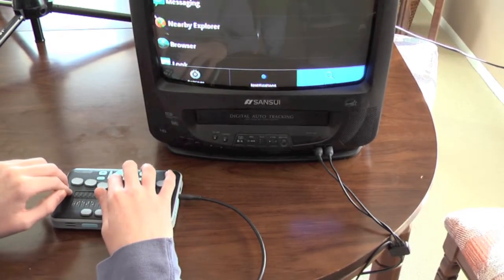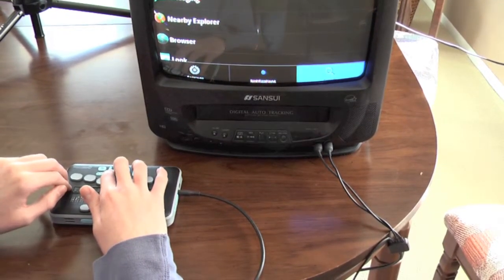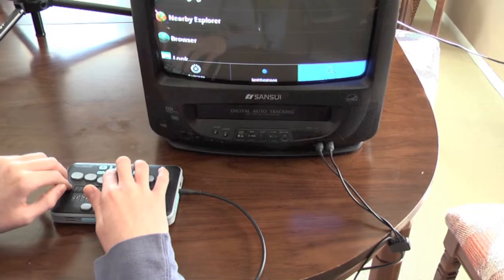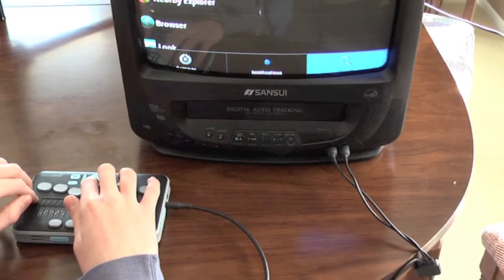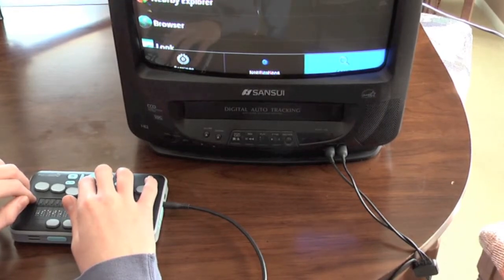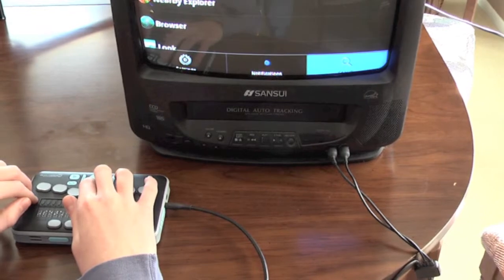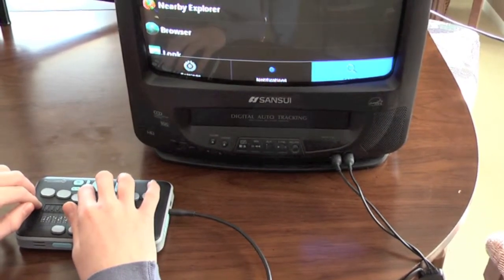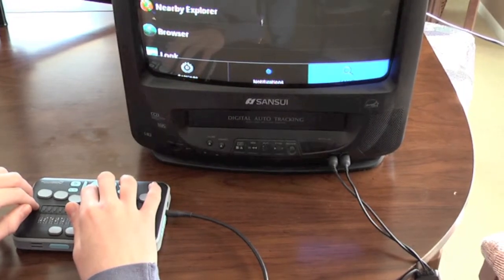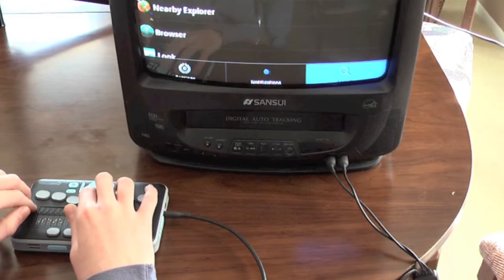In that case, once you use your left and right arrow keys to pick the option you want, then use the select key. The next menu or secondary menu that pops up, those secondary menus would be oriented normally like the home screen, which is vertically. So you would use your up and your down arrows. So just remember that anytime you press the menu key, you'll need to use your left and your right arrows. Any menus you access beyond that will be accessed with your up and down arrows.